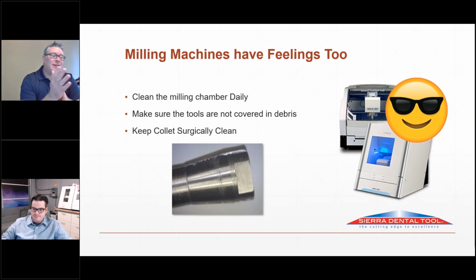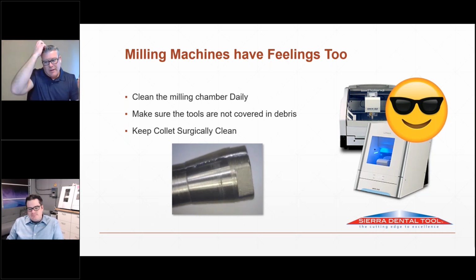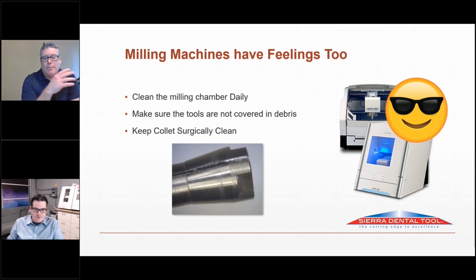And it was hysterical to me because the guy running the machine just let it get dirty. It's like having a sick employee at work. They're just not going to put the effort into it. They just don't. And the same thing with this mill. So big advocate of keeping the machines clean.